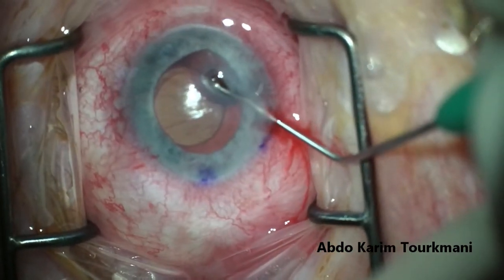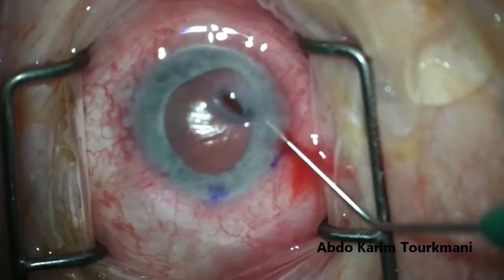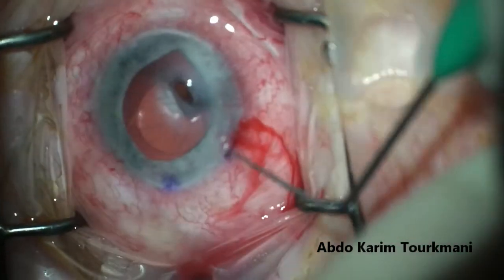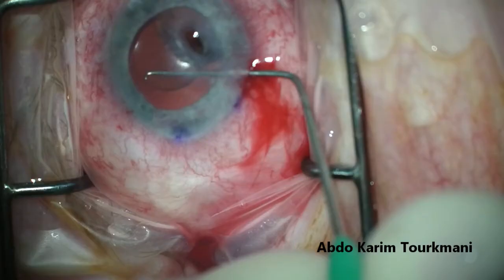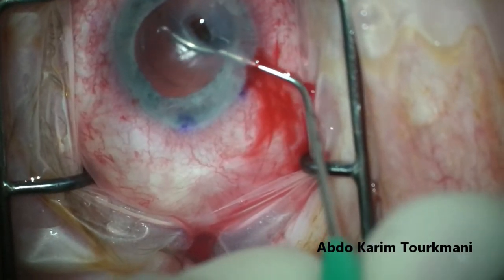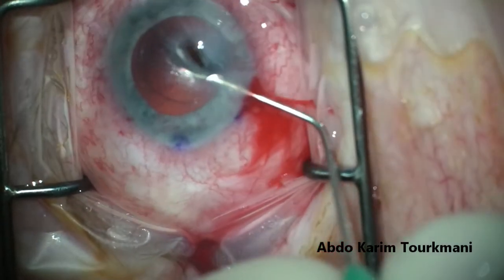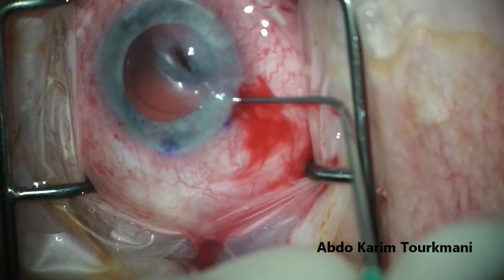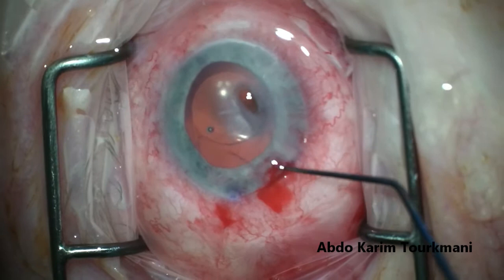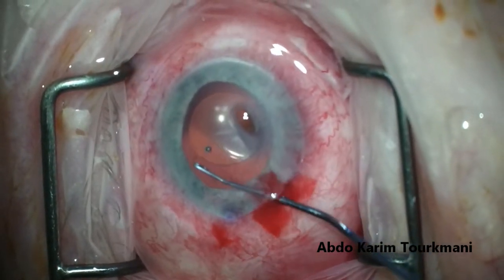So I decided that I would reposition that lens in the sulcus, given that it's a one piece rigid PMMA lens. And since those lenses, if entirely in the sulcus, have a tendency to subluxate through the zonules, I would perform optic capture so the lens would remain centered and stable. So first I'm prolapsing the haptics into anterior chamber, and then very gently I'm going to reposition the haptics in the sulcus and perform optic capture.